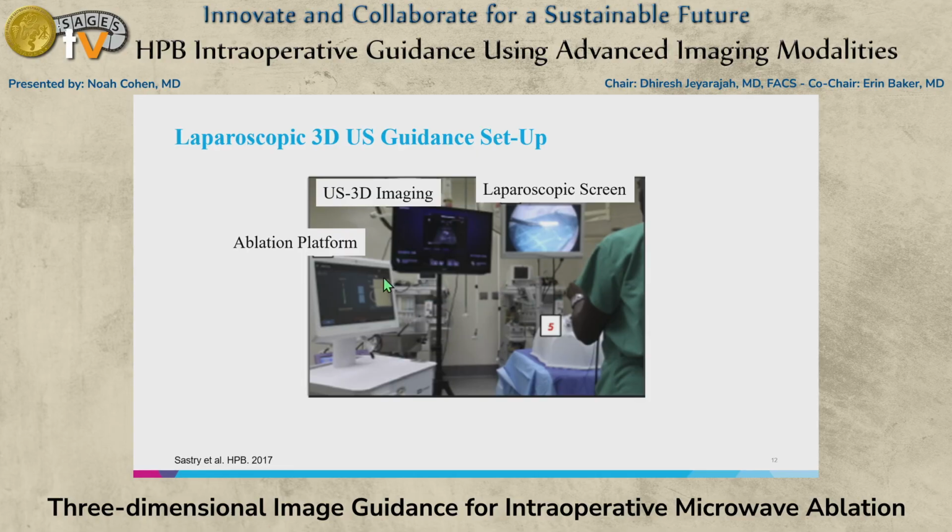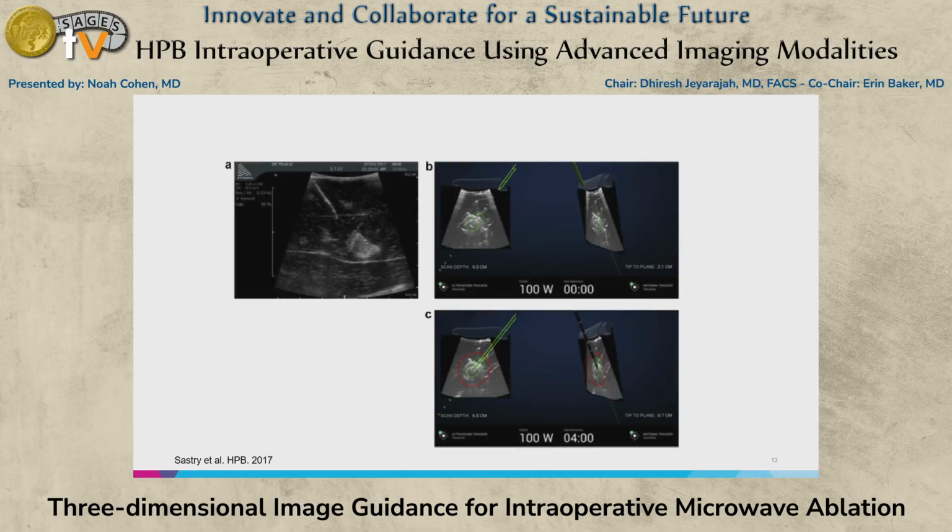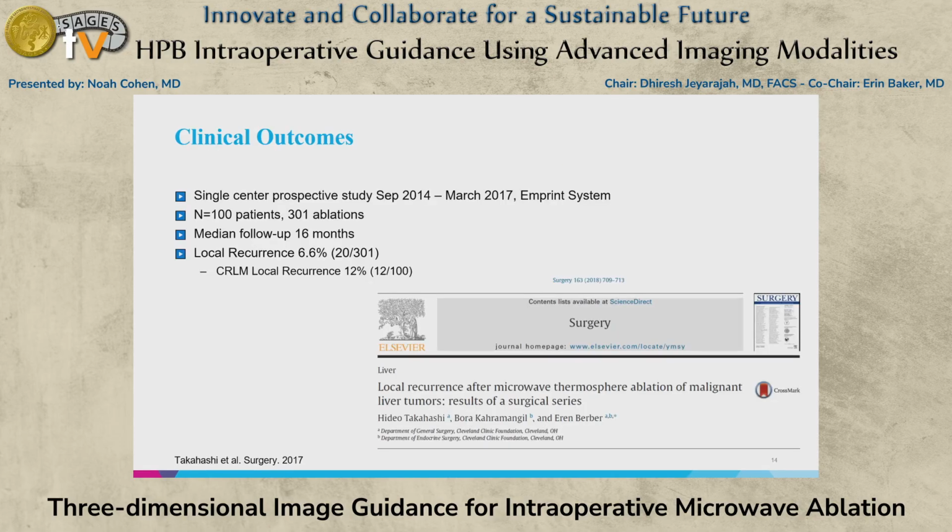This has now been just the ablation platform and the 3D imaging seem to be on one screen now with the newest update. But this is from their publication. So you do have to have your eyes lots of places. And again, taken from their publication, what this looks like.